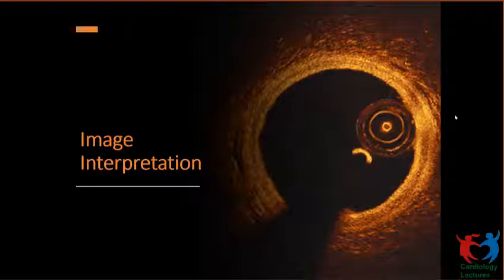The distalmost marker can be just near the tip of the wire in distal vessels. Very nicely, it's a very good and a very important question which you put. So it should reach till the end, but not come out of the end of the wire, because you have only 20 millimeters and it should not come out. Even if it straightens the terminal end of the wire, absolutely no problem.